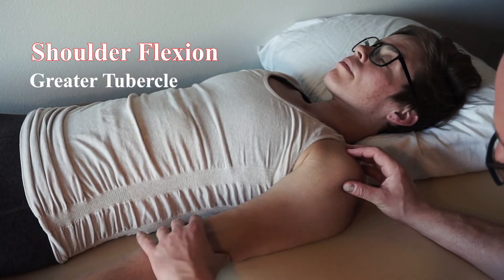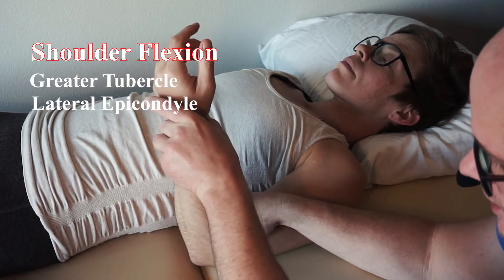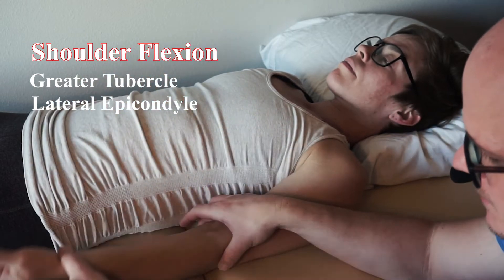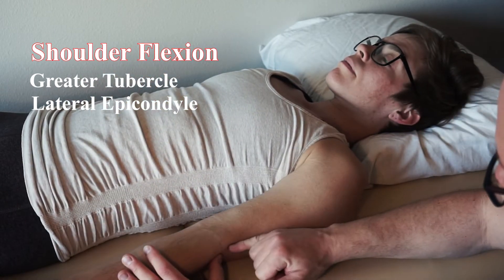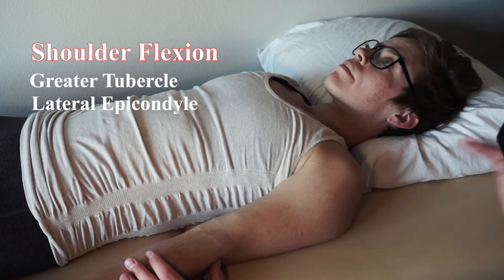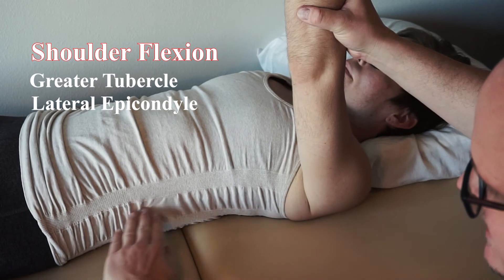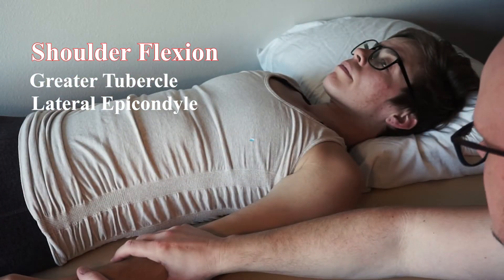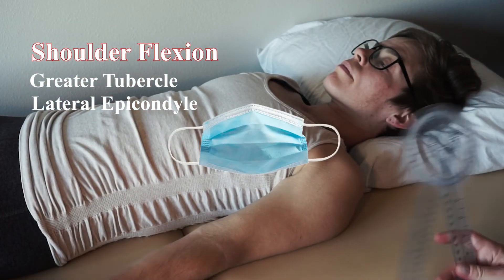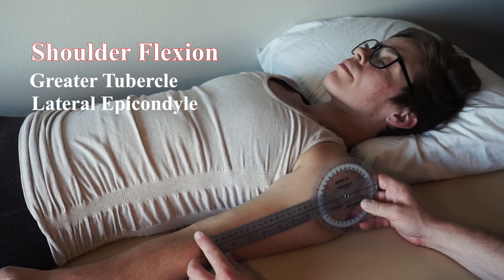Our moving arm is going to get down to the lateral epicondyle of the humerus. Make sure you don't get on the radius. The tests might also talk about just bisecting the humerus. Then the stationary arm, once the arm is up and out of the way, will bisect the midline of the body and stay there. This is what it looks like when you initially set that up.